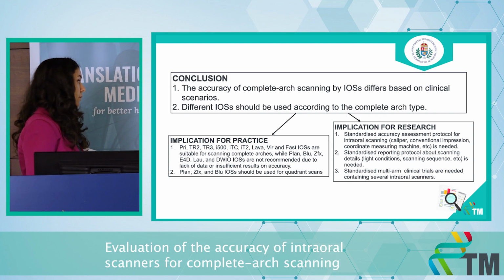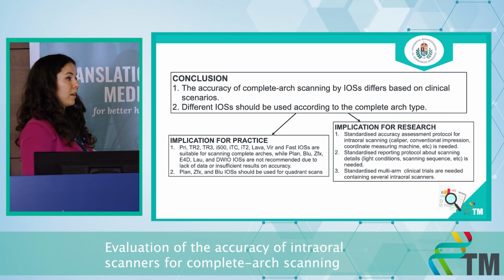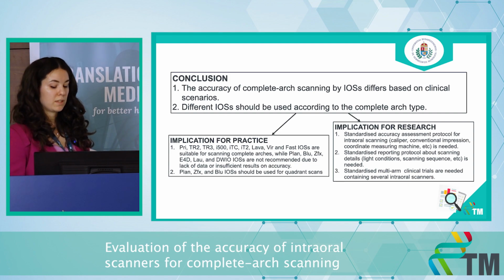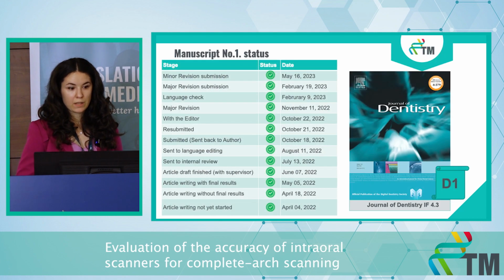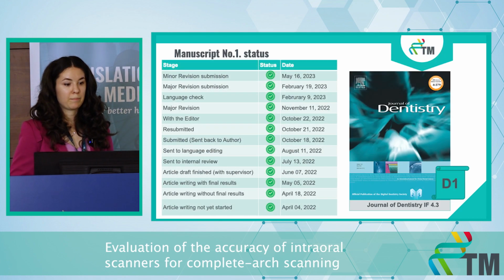And of course, there were IOS which were not recommended for complete arch scanning at all, just for quadrant scans. And for implication for research, we mentioned that standardized protocols are needed for further research. This manuscript is in minor revision phase at Journal of Dentistry.